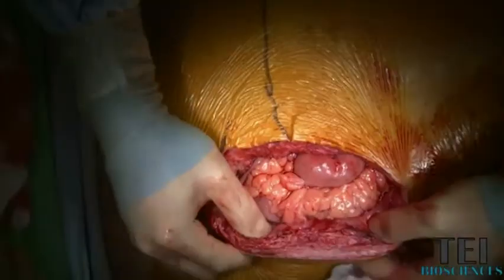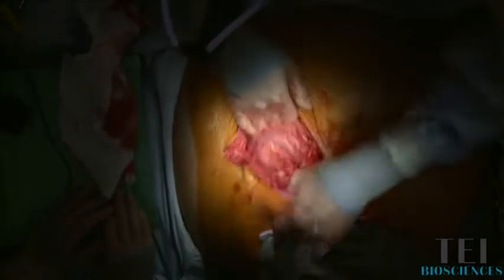We're going to do a standard underlay bioprosthetic mesh with primary myofascial closure and a unilateral component separation on the left side.